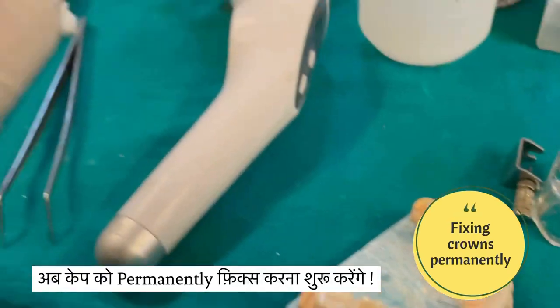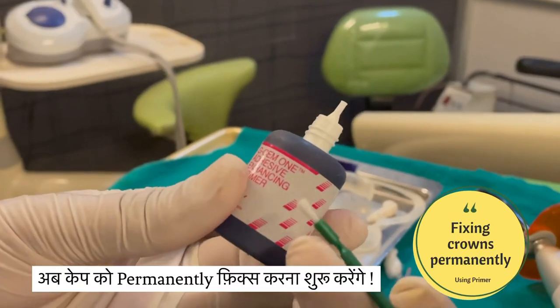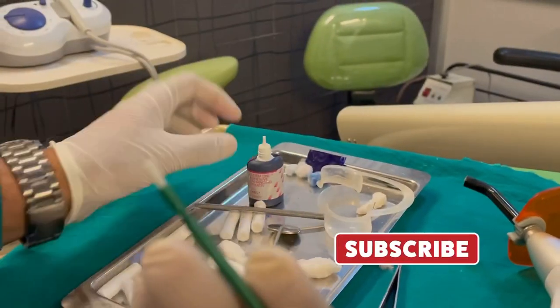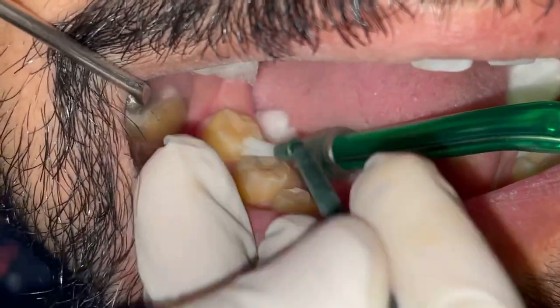When compared to basic PFM crowns, which contain metal inside, those crowns may expose the underlying metal over a period of time, which may not look good aesthetically. This doesn't happen with zirconia crowns, which is why zirconia is more preferable for aesthetic reasons.